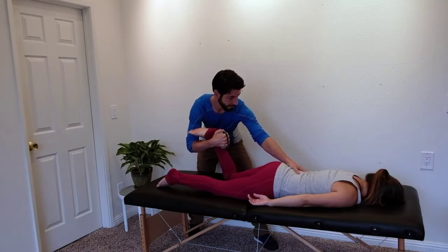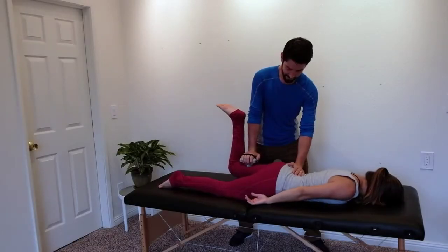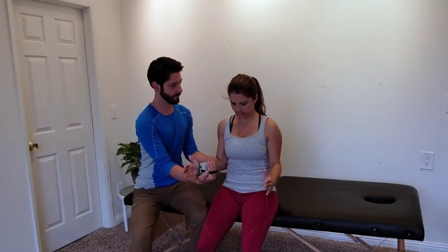Remember, there's nothing new to learn here. Just utilize the manual muscle testing positions you're familiar with and use the dynamometer in between your hand and the point of resistance. The clinician's body position, points of contact, patient positioning, they can all remain the same.